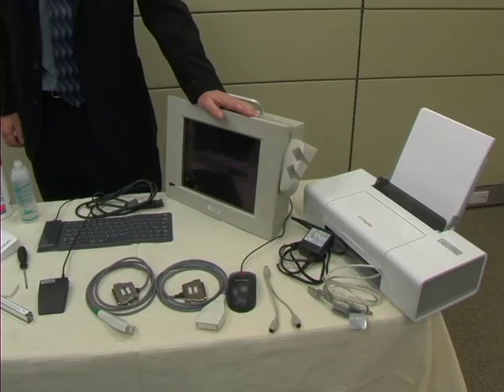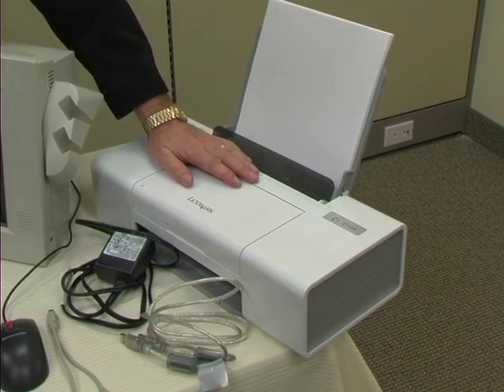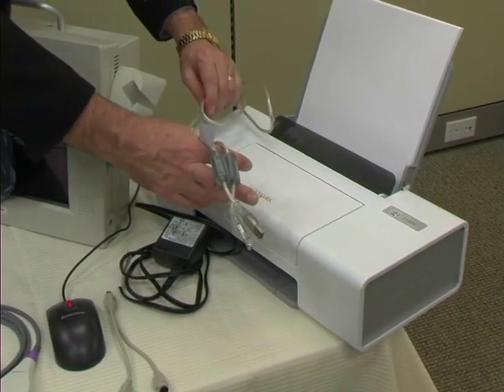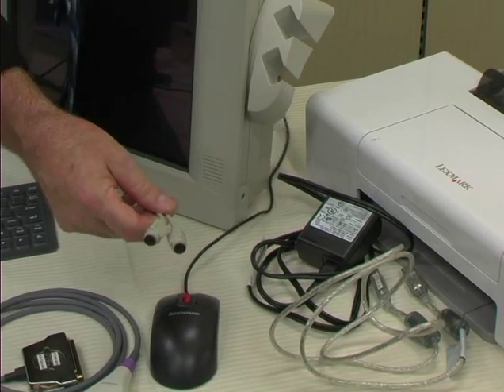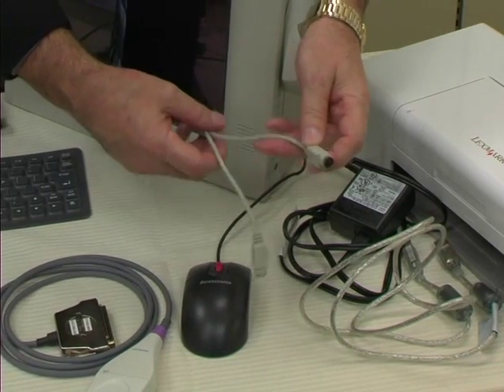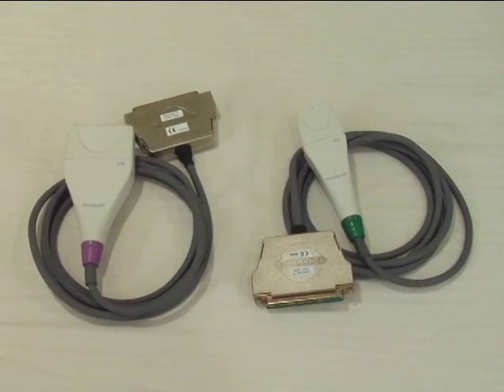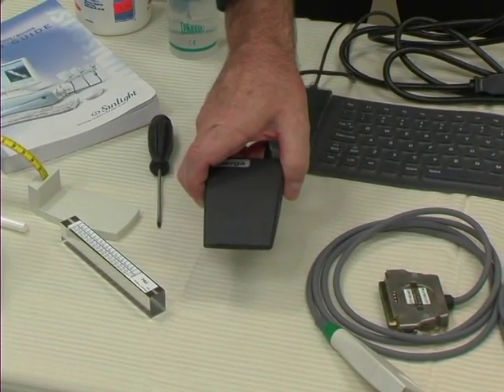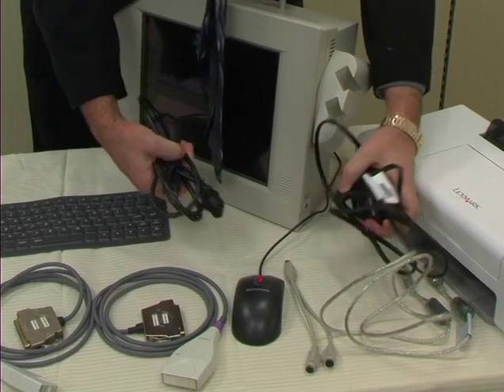First of all, we want to ensure that all the components are accounted for that we'll need to run the test. We have the Sunlight Omnisense unit, a keyboard, a mouse, the printer, and all the connecting cables and an adapter. The adapter will be used to connect the mouse into one receptacle, the printer into the other receptacle, and then the main receptacle into the unit itself. We've already mentioned the two probes. We have a foot pedal and two power cables — one for the unit itself, and the other for the printer.